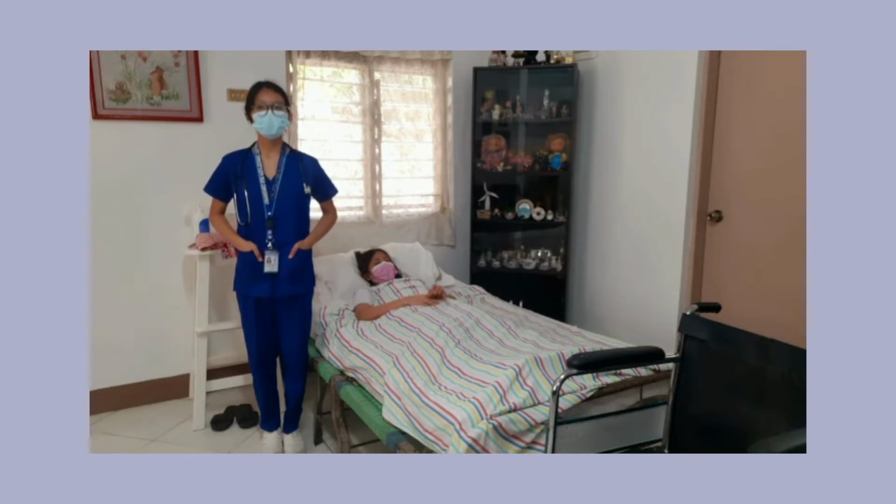Which variations the nurse selects depends on the factors related to the client, the environment, and the healthcare provider that are assessed prior to beginning the transfer. Number 1. Assessment.